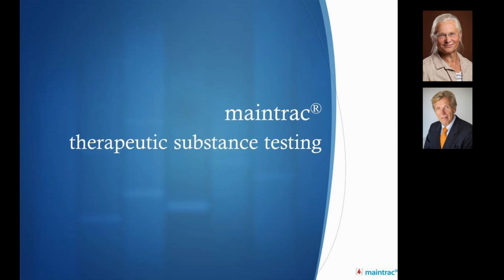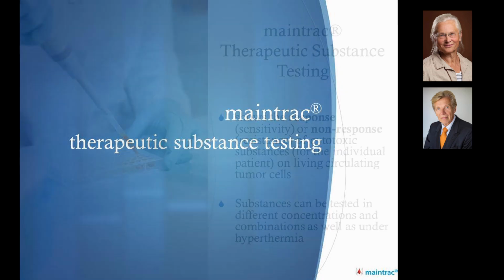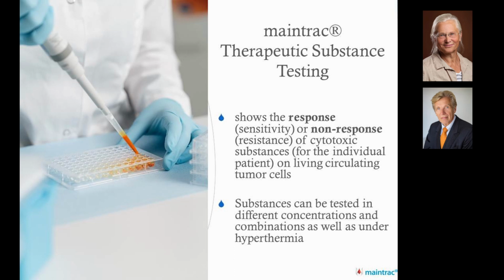So I would like to show first the therapeutic substance testing. For this purpose, we use the living cells and expose them to the therapeutic substances in the concentration which you later want to use in your patient.